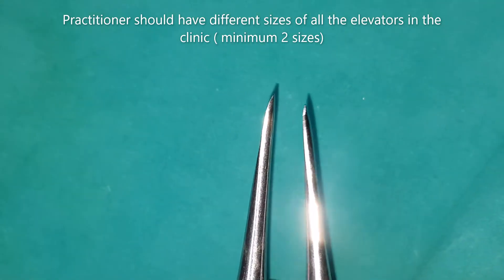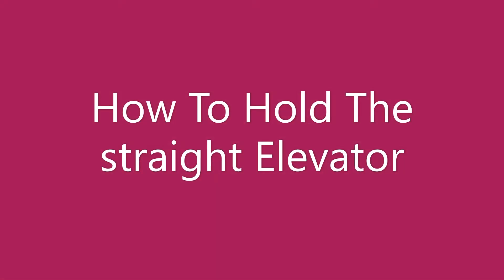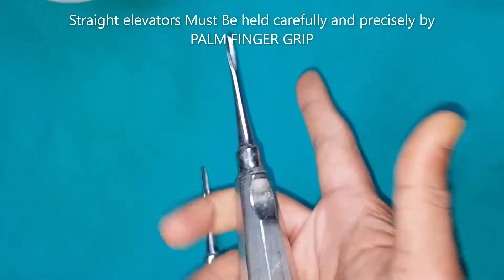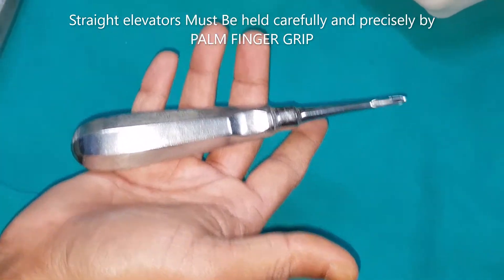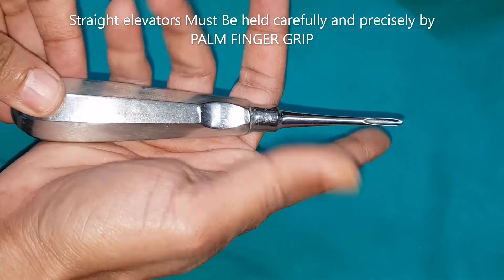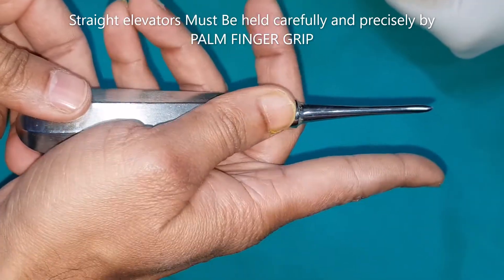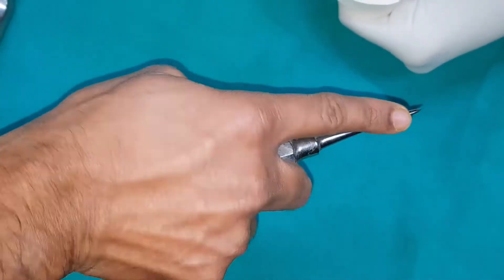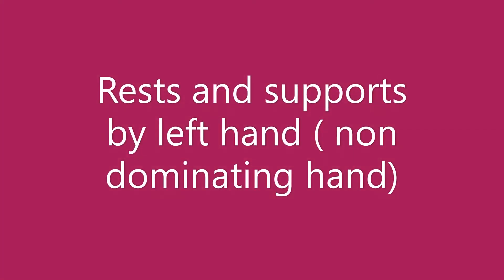To hold the straight elevator correctly, place your elevator on the palm, aligned parallel to the long axis of the palm. Now place the thumb over the thumb depression, and keep the index finger parallel to the blade. The concavity should be facing the tooth to be elevated. This is how you hold it.